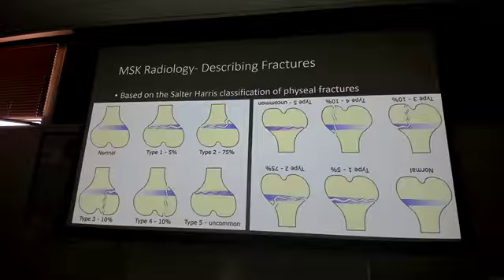Which means, if you're having a test question, type 5s are almost impossible to see unless you're a pediatric radiologist. Probably not going to ask you to pull out a type 5. But boy, there's 5 Salter-Harris types, so what an easy 5 answers I could have for an x-ray or 2 to try to pinpoint these things, right? Probably not gonna give you a 5.